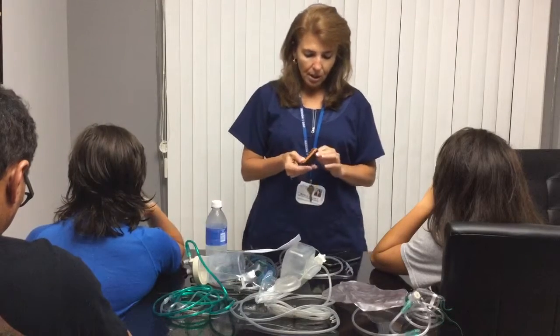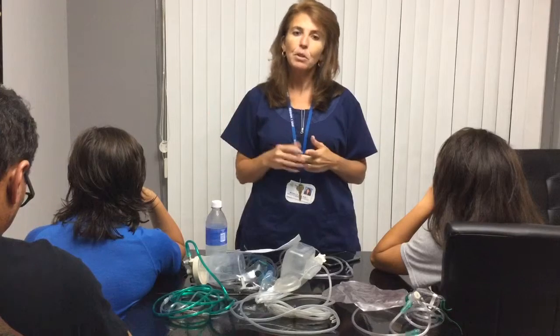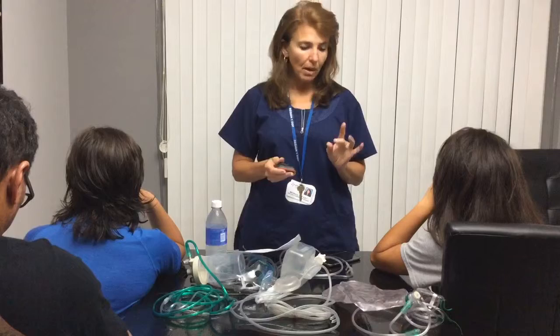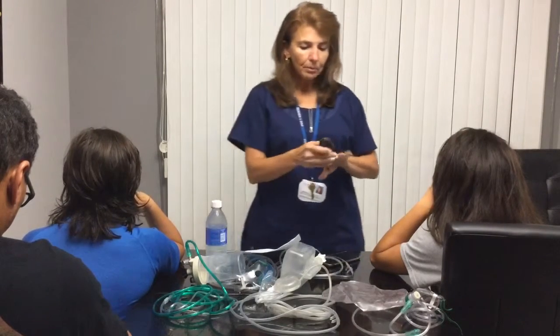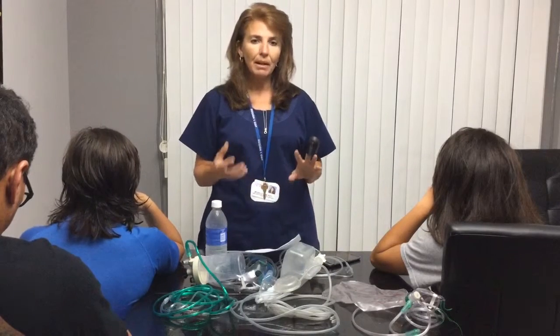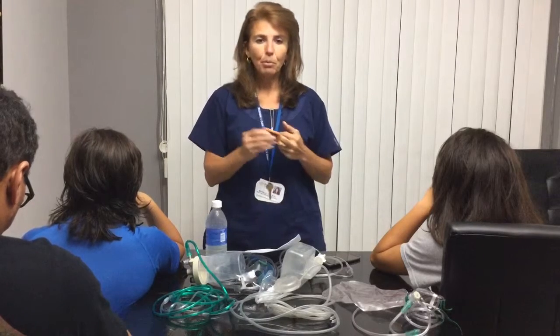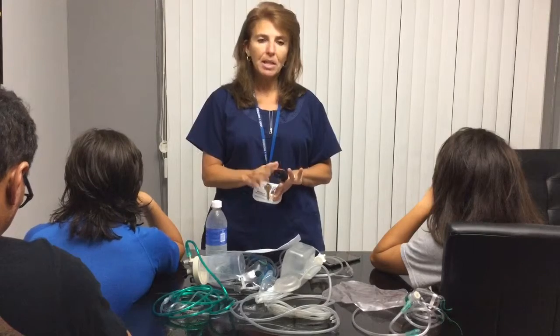We tell our staff to use the non-dominant hand, because if you use your dominant hand, you get a lot of artifact. Usually you have the best pulse in your middle finger. Once you apply the oximeter, we want to make sure that we're waiting at least 15 to 30 seconds so that we can have an accurate reading. Far too often we see staff put the probe on the finger and then take the first reading they see, but we would like the reading to stabilize.